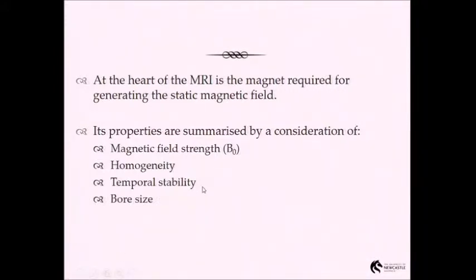Temporal stability is just saying that we want it to be the same day after day after day. And the bore size. I already mentioned that when I started doing MR, with a 55 centimetre bore, my shoulders would touch the side of the imaging bore. That has implications for heating up and potentially burning the patient. When that occurs, you just put pads to isolate them from the side of the bore.